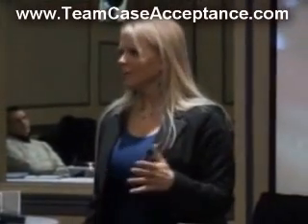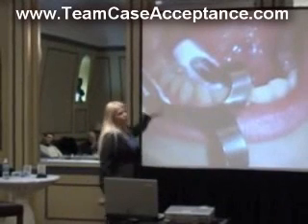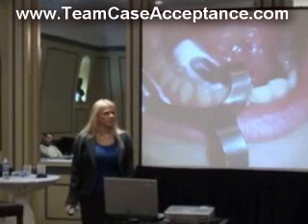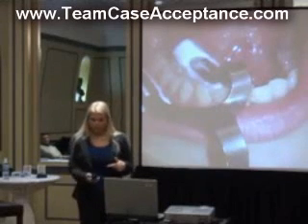So other tips I could give you is use good tools. This is old school. It's a cotton roll holder. I think they call them a Garmer. I love the thing. Isolites work great. There's a lot of other things that really help you, but look at how that's isolated. I actually etch and seal the entire quadrant at the same time. 4 quadrants of sealants take me about 10 minutes for 16 sealants. So if you refine your systems, you'll be amazed at what you can do, okay?